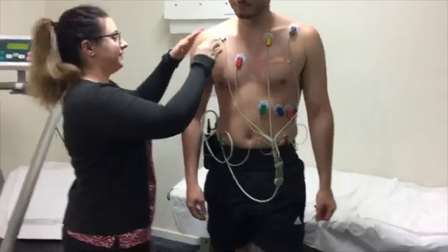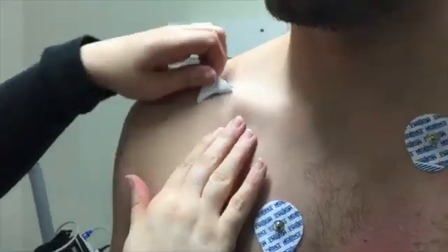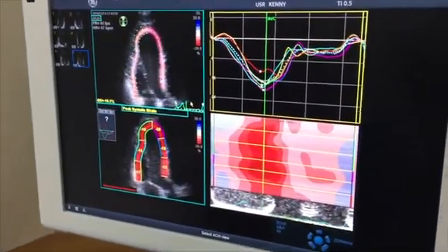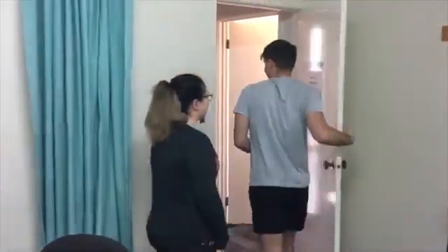When all images have been obtained, you will be asked to sit up. After a few minutes, the ECG leads will be disconnected and the ECG electrodes will be removed. A cardiologist will look at these images and will write the final report, which will be sent to your referring doctor. Thank you for choosing Heart West.